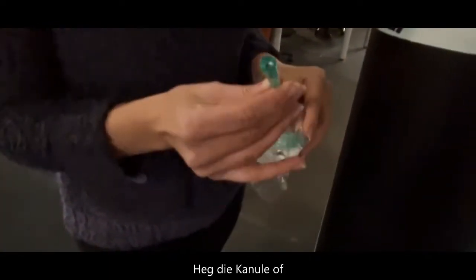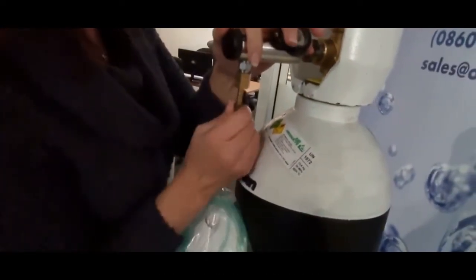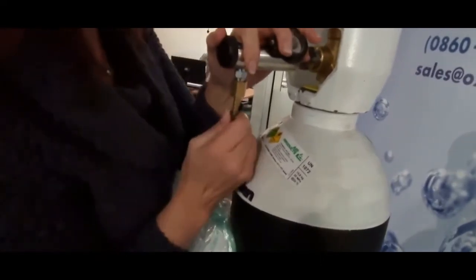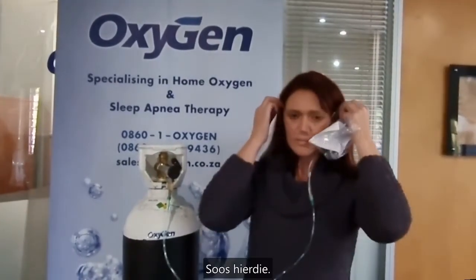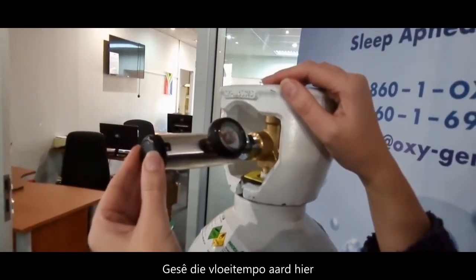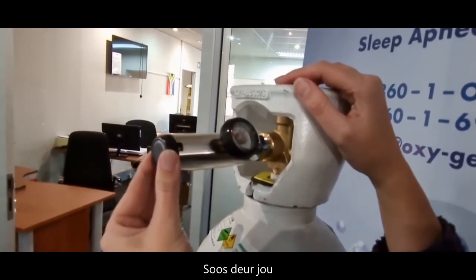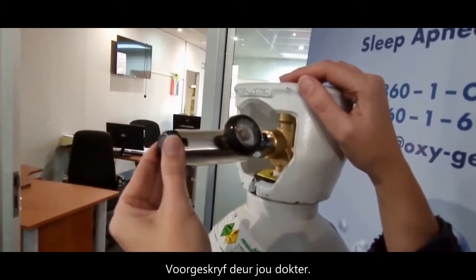Next, attach the cannula or the oxygen mask here like this — make sure there is a firm fit. Place the cannula like this, loop over your ears, and gently tighten under the chin. Next, set the flow rate as prescribed by your doctor. Never exceed the flow rate prescribed by your doctor.